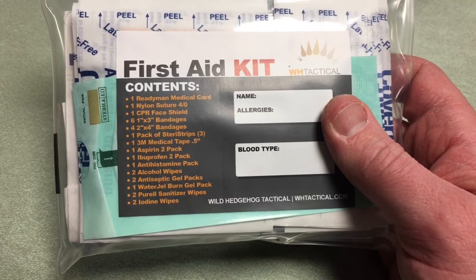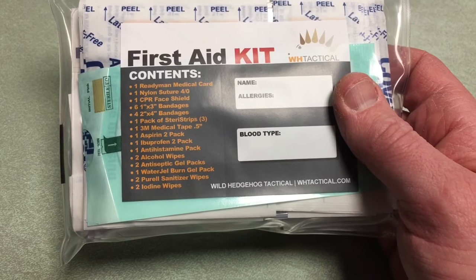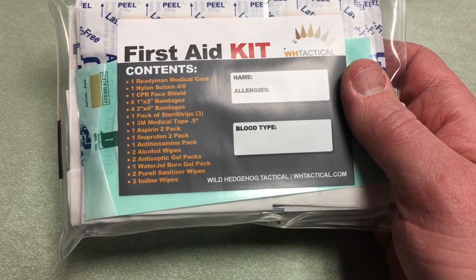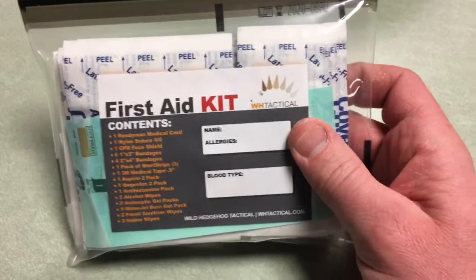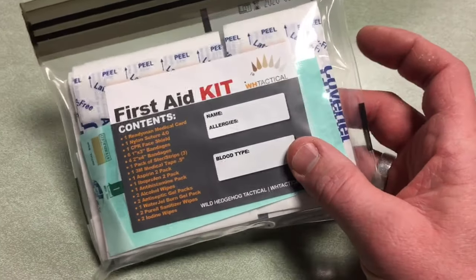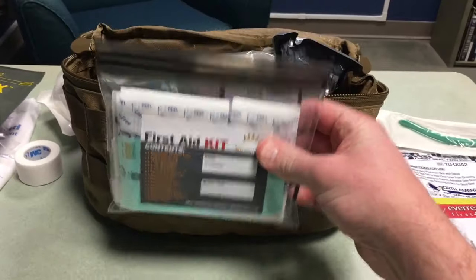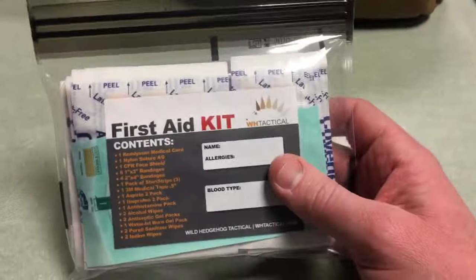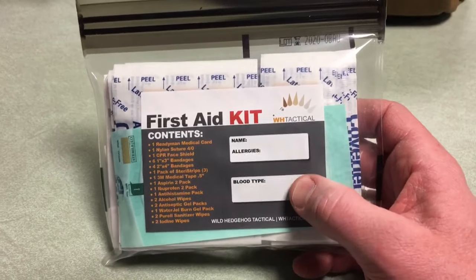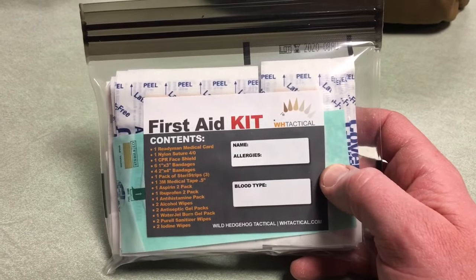The first aid kit contains bandages, medical tape, aspirin, ibuprofen, antihistamine, alcohol wipes, gel packs, water gel burn gel packs, and iodine wipes. This is the type of thing for basic bumps and bruises. I'd definitely want to keep it in the kit but maybe in the front section — just unzip and grab it for somebody who got a scratch or a cut. You want to clean it up and put a couple band-aids on it; this is a good thing to have.